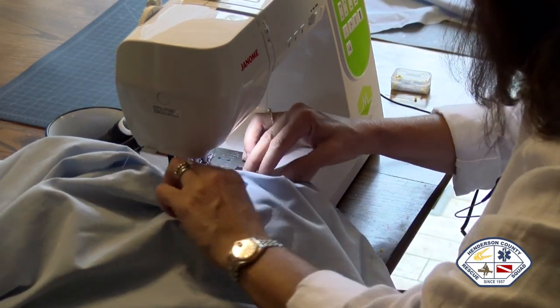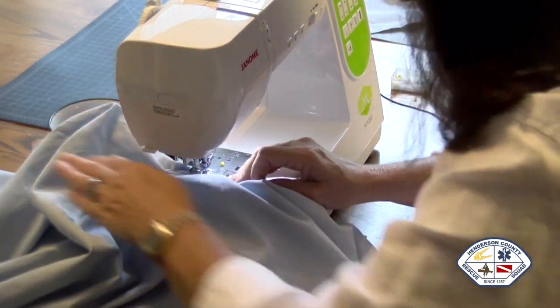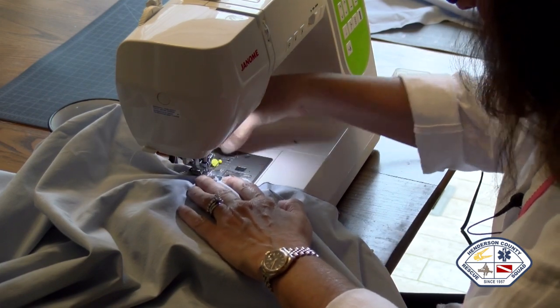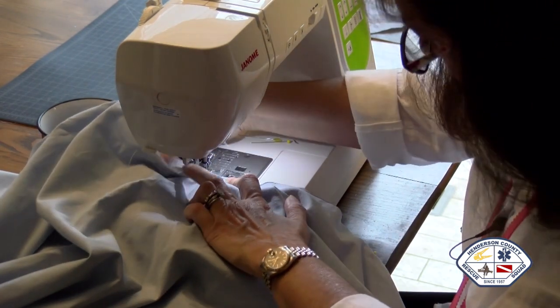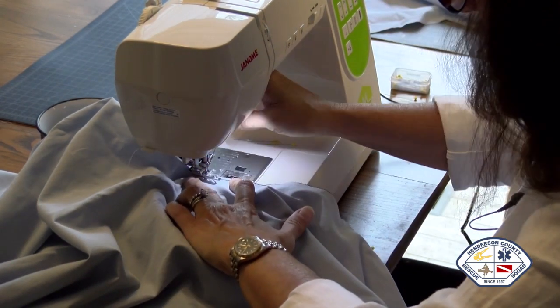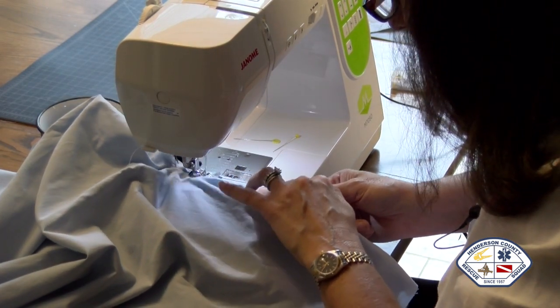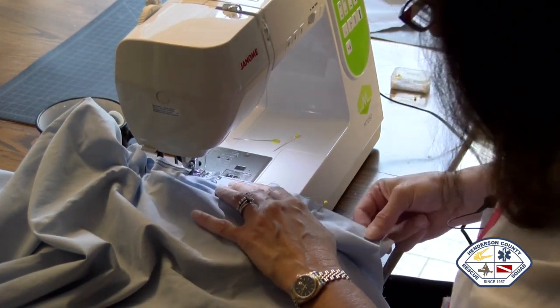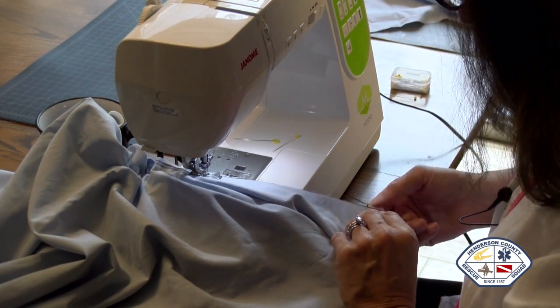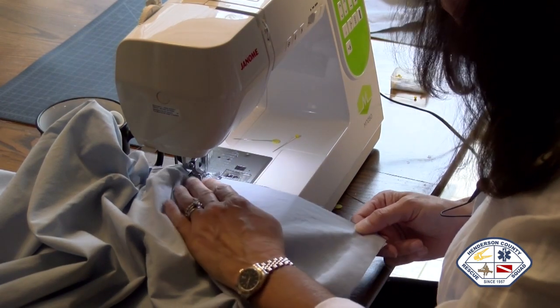But because there's so much fabric right there, you've got to make sure it's all nice and flat so you don't have any, what my grandma would call, you don't want it to booger up. She was a very southern lady. Let's see here. Stop. There we go. All right, and we're sewing on the outside of those black lines. We're sewing with black thread, and that's primarily so you can see what I'm doing.